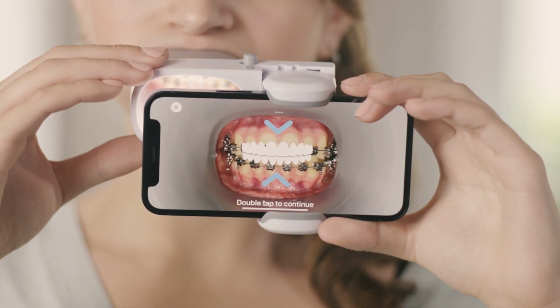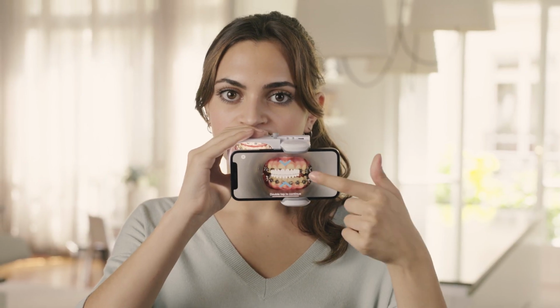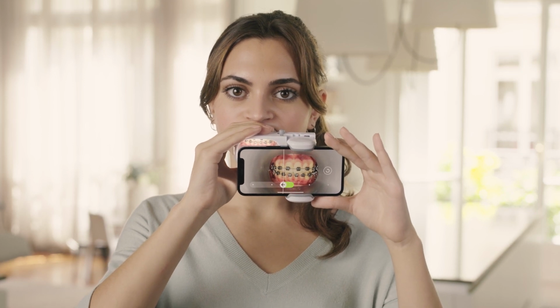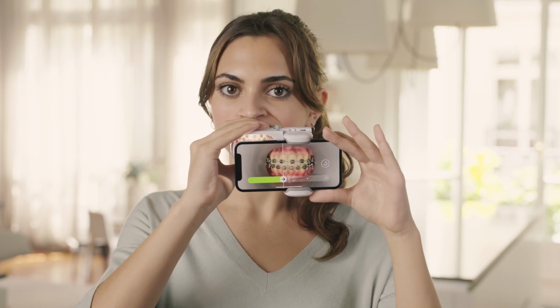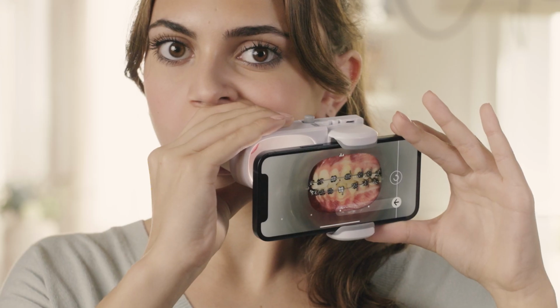For this step, bite down on your back teeth and keep your teeth together. Let's go! Double tap on the screen to start the scan. Shift the scan box to one side as soon as you hear the camera make a sound. Now shift the scan box to the other side. Scan all the way to the side to make sure your back teeth are well seen.